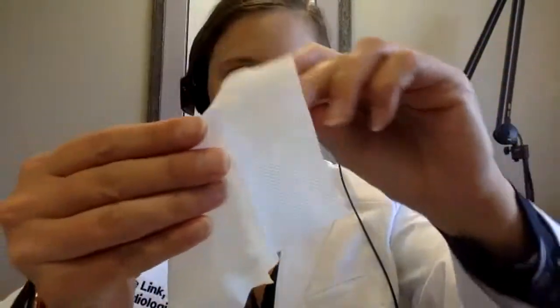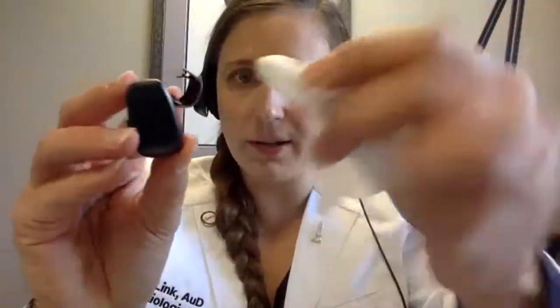Okay, I know that I'm not a fan of Q-tips, but this is one of those opportunities when it might be useful. You can put that Q-tip in the end here, wrap it up nice and tight. And then you can go into those contacts, connect with the battery. Be careful, though, or you're going to not have power, or you'll move that contact and the door won't shut anymore. So just be careful, be gentle, but if you see that in there, go ahead and give it a try. Probably not going to make the situation worse. Okay.